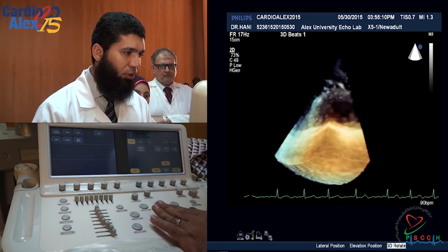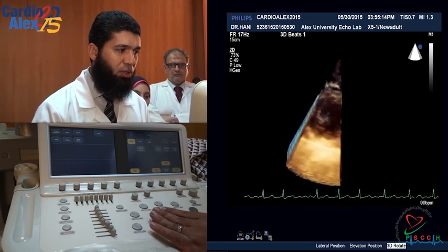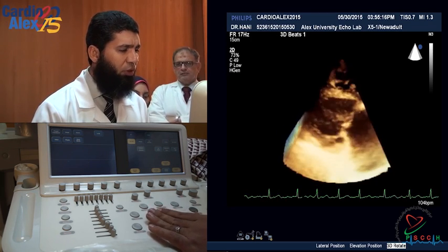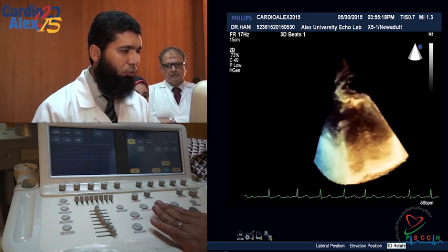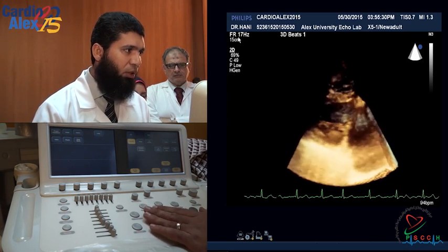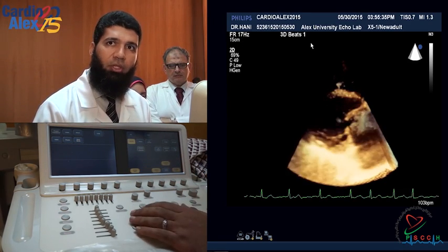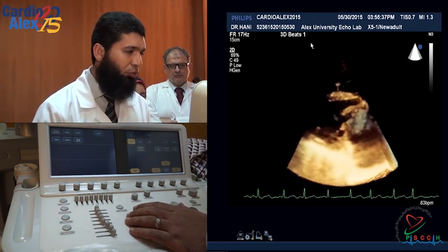If I rotated the image, you can see it is narrow sector acquisition. This is the depth or elevation width. It is narrow, but it is live because it is 1 beat acquisition. Frame rate here is 17 volumes per second, 17 hertz. Because it's narrow, I preserve the frame rate, I can get a high frame rate.